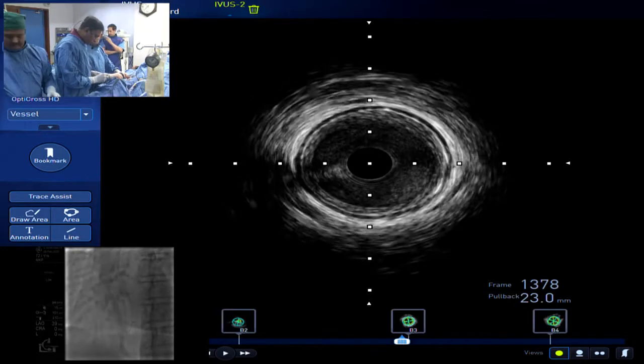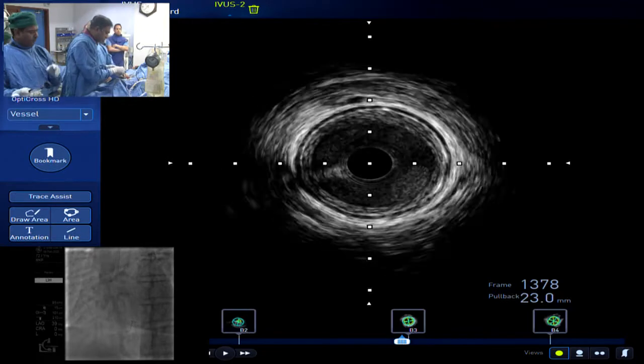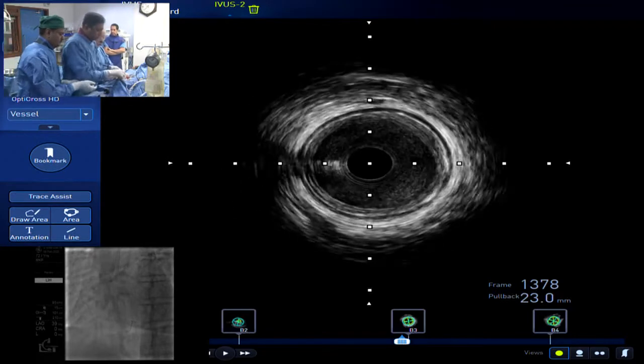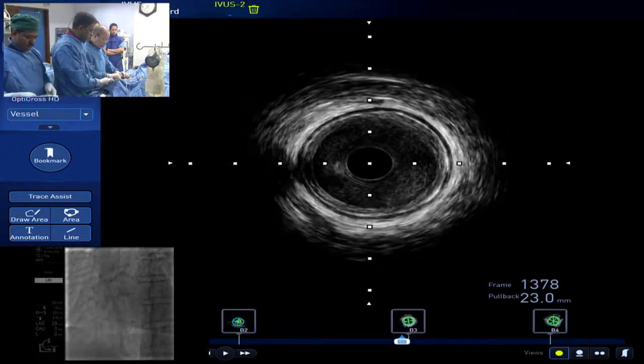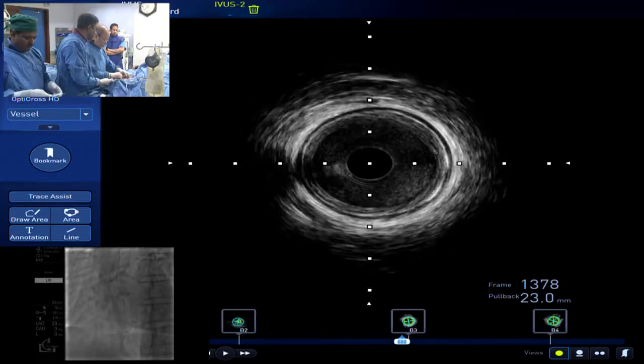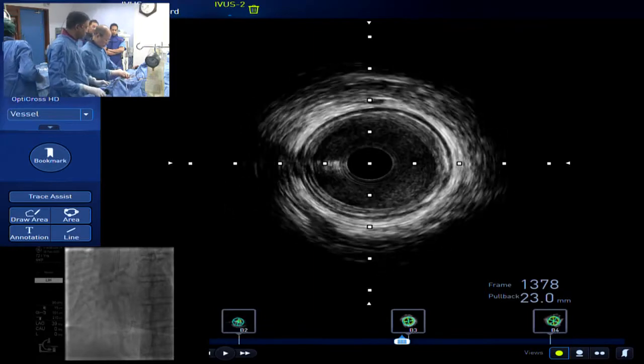So what is the strategy now? Are we putting the anchoring balloon back in, or are we going to maybe pre-dilate some more? Pre-dilate more. Yeah, I think he wants to dilate more. Look, as you thought, there was quite a severe lesion proximally, didn't there? Yeah.